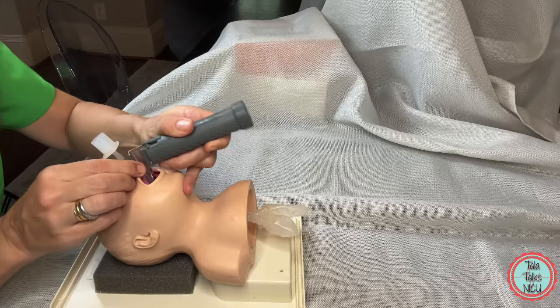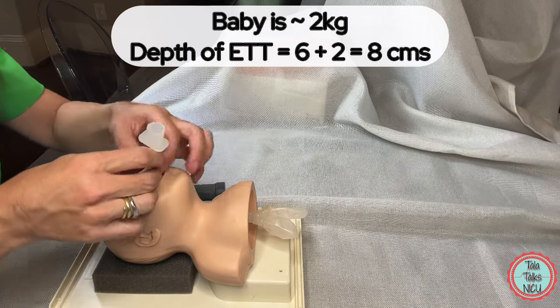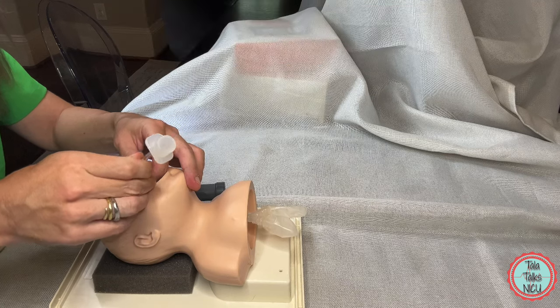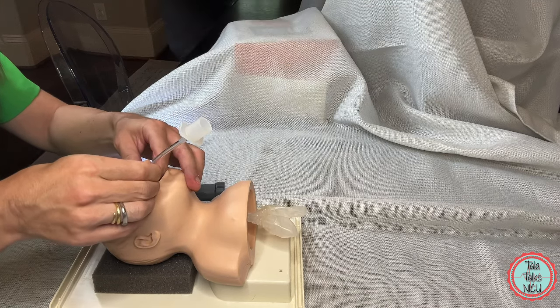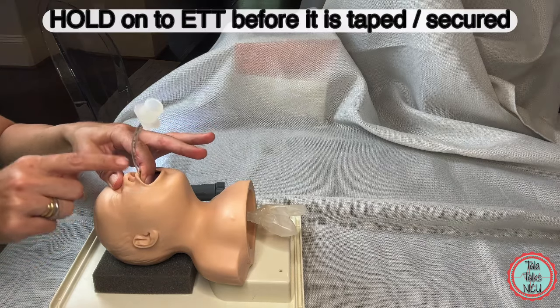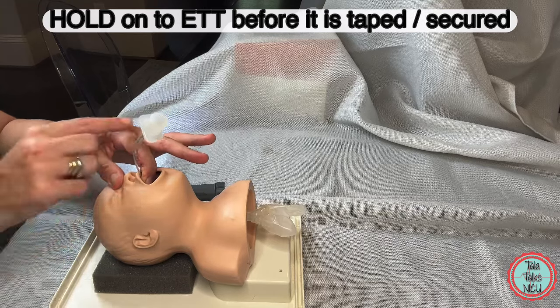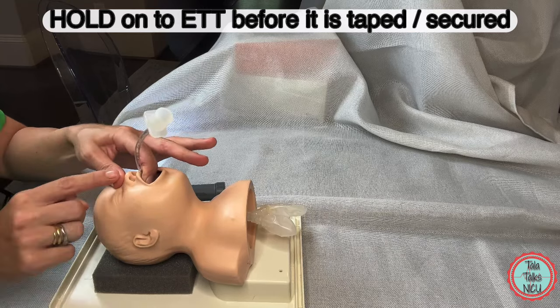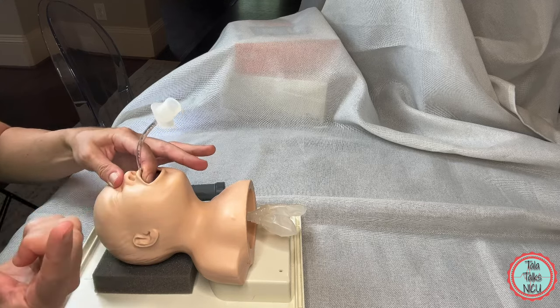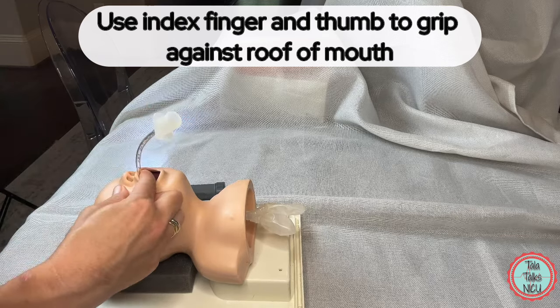In this baby — let's assume he's about two kilos — we probably want it in about eight centimeters. We'll talk about that next time. I'll pull it back to eight centimeters since I went in way too far. The key thing is that you're holding on to this endotracheal tube while making sure it's in the right position, and then the RT and everybody else is securing it. I grip it with my index finger and thumb against the roof of the mouth.